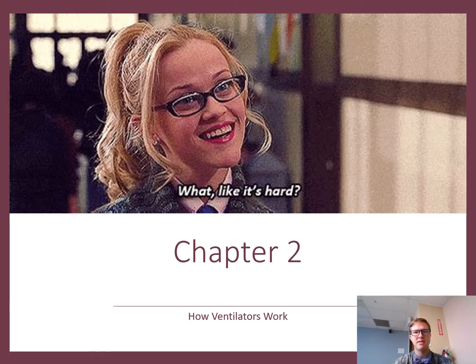But the big thing is going to be focusing on the patient-ventilator interactions, or how the patient and the ventilator interact with the breathing pattern, right? Because how we set the machine is delivering the tidal volume in a specific breathing pattern. And we're also going to look at how the patient's lung conditions can affect how the ventilator performs, right? As the patient's lung conditions change, which can be a breath-to-breath thing, that can affect how the ventilator performs and does its job of supporting that patient.